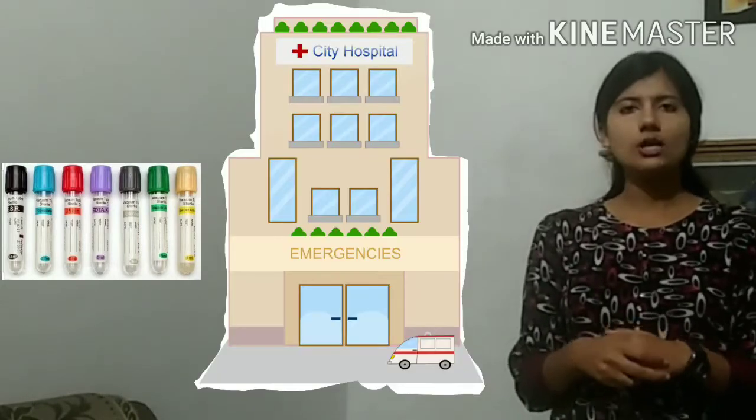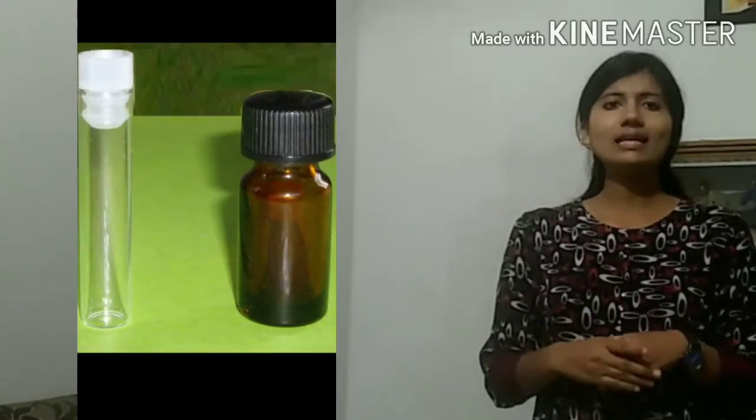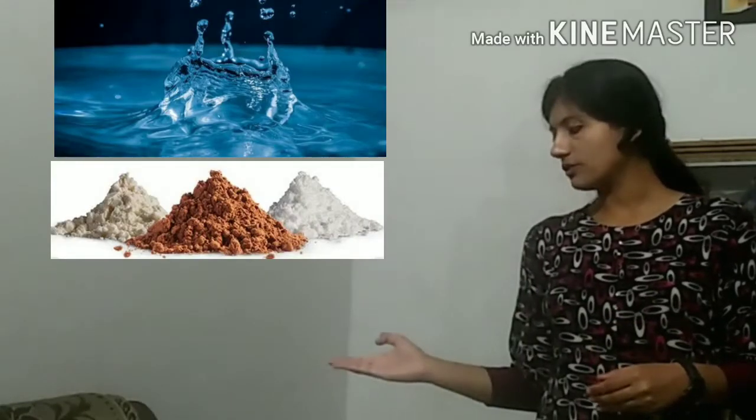You might have seen different color-coded vials while working in hospital laboratories or in medical fields. So what vial am I talking about? A vial is a small glass or plastic vessel or bottle often used to store medication as liquids, powders or capsules. So why this color coding?